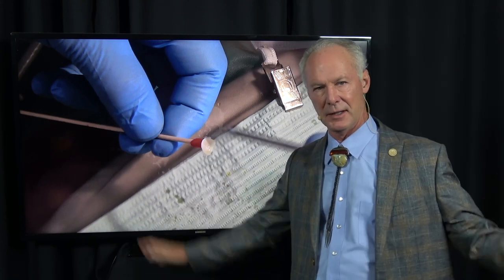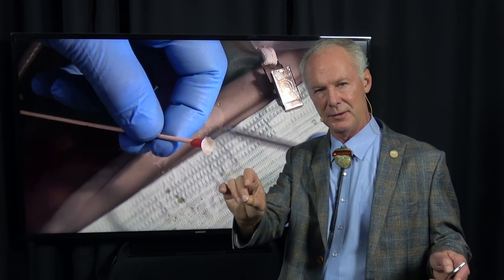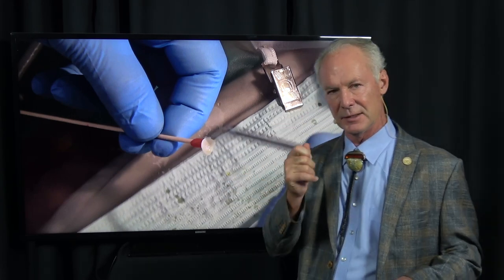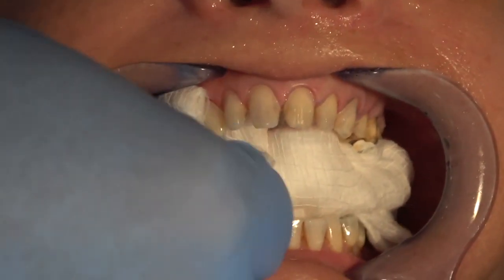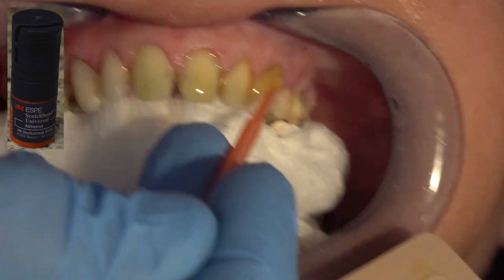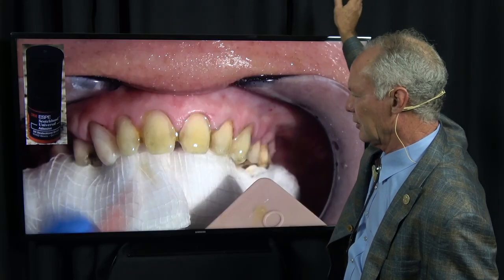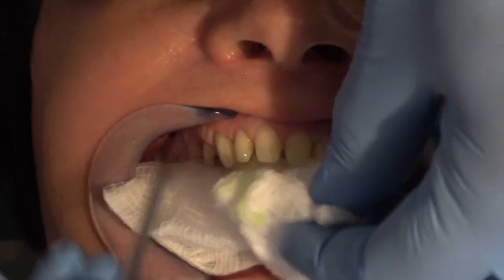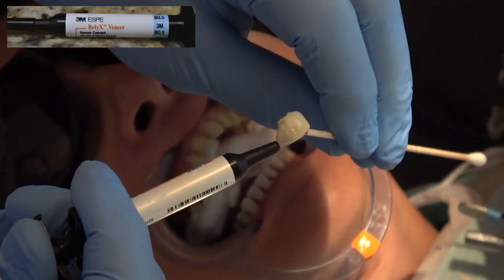This is my technique that I've used for more than 20 years. I don't want to bring out a curing light until everything is on the tooth - the primer adhesive and the veneer with the filled resin. So I don't cure it until I cure everything at the same time. I'm blowing this off, then rinsing the teeth and blotting them dry. I like a little bit of moisture on the teeth. Then I place a copious amount of primer adhesive on the teeth, and place a two-by-two around the teeth and blow all the movable primer adhesive off.